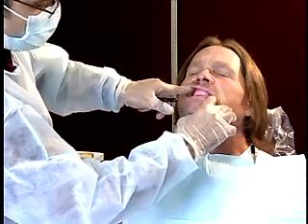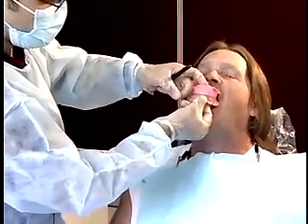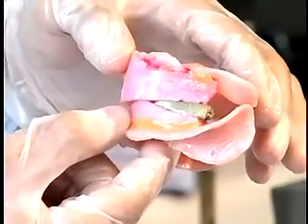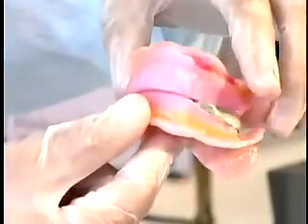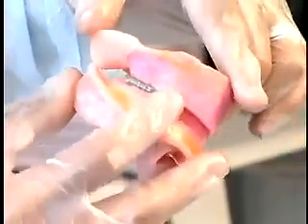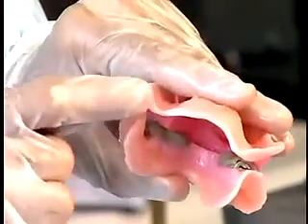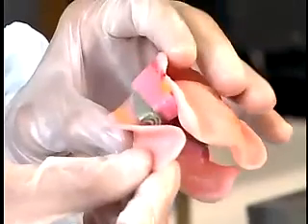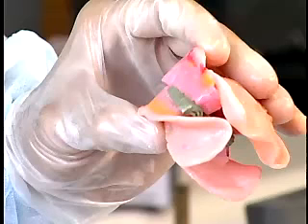After the recording medium has set, remove the record base from the patient's mouth and inspect it. There should be no contact between the acrylic bases, wax rims, or master casts. Return the record to the mouth and check it for repeatability. This record must be repeatable. After you have completed your centric relation recording, you are ready to mount the maxillary and mandibular casts.